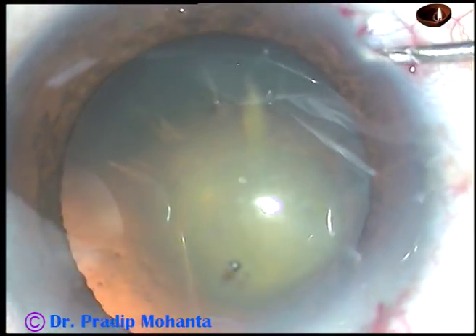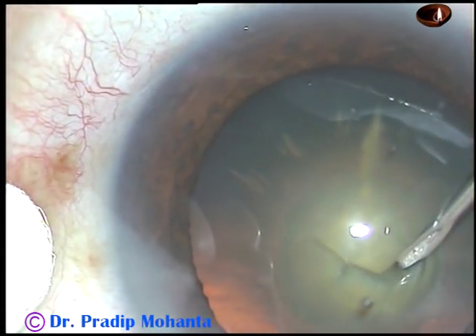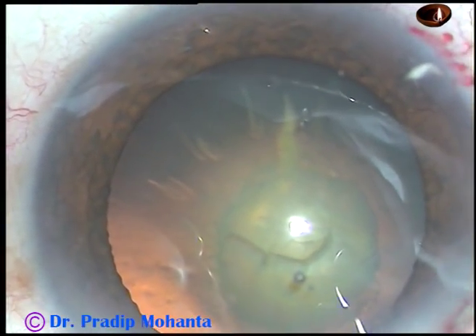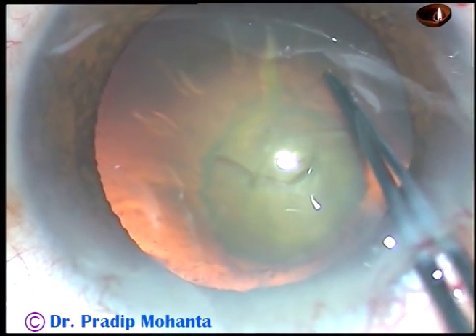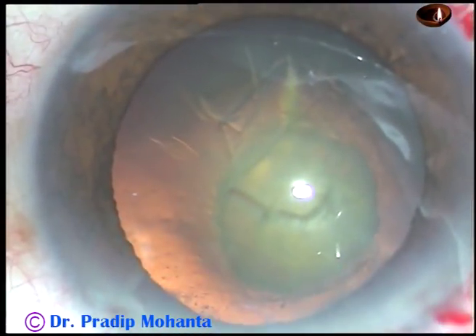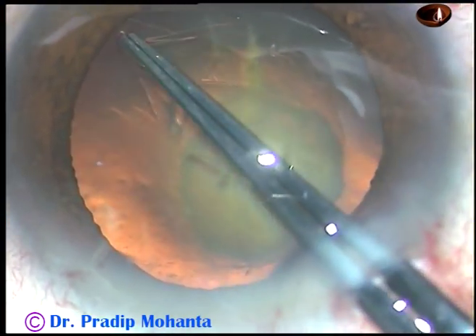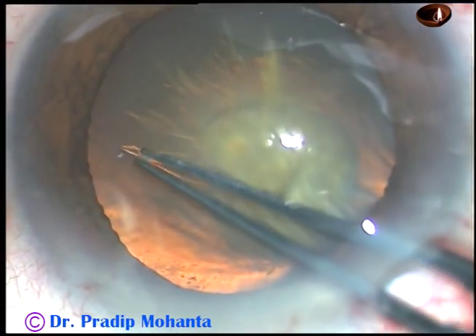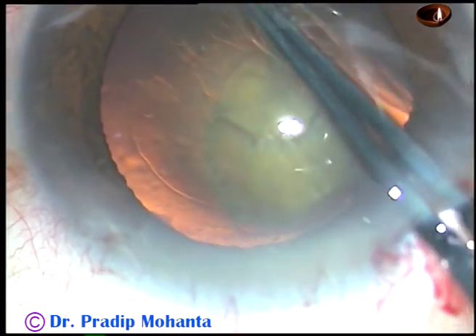In this case, I want to make a rhexis of about 5 mm diameter, because if PCR occurs, I should be able to place the lens in the sulcus and do optic capture if the rhexis is of that size. Capsulorhexis is to be done, and it has been a very nice continuous curvilinear capsulorhexis.